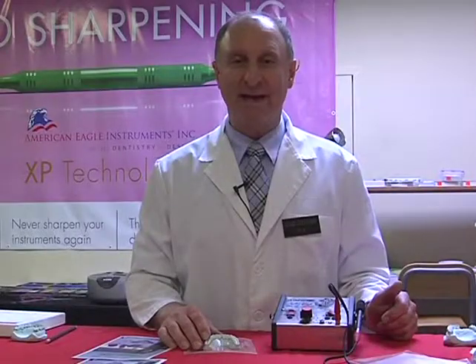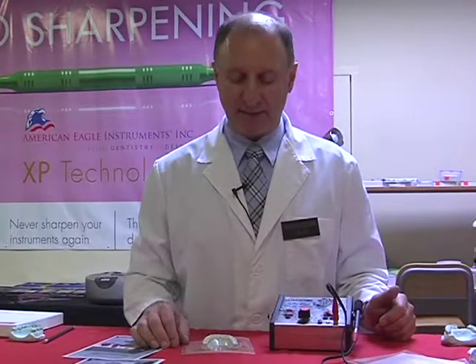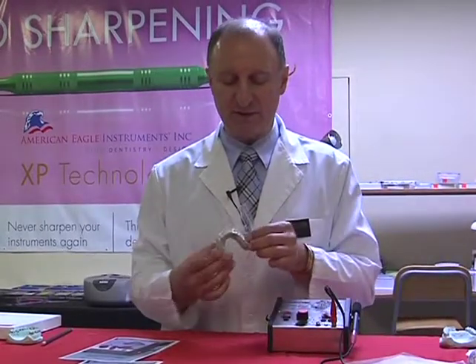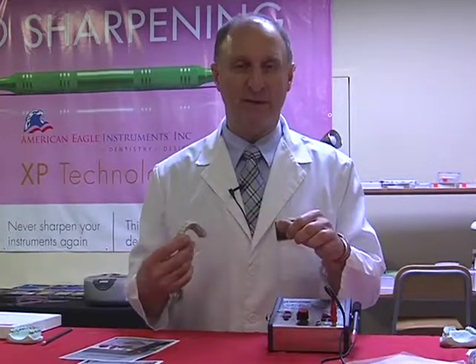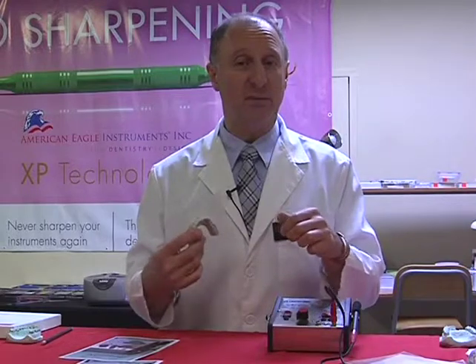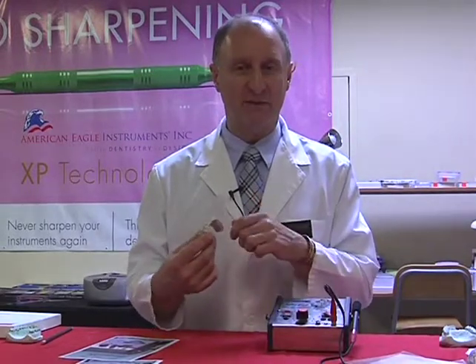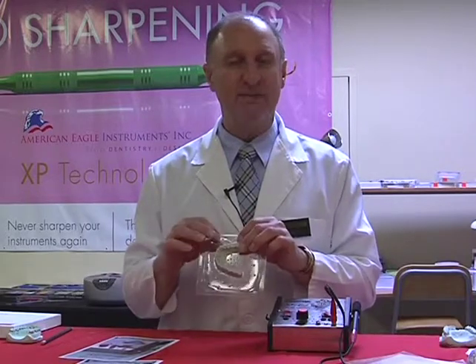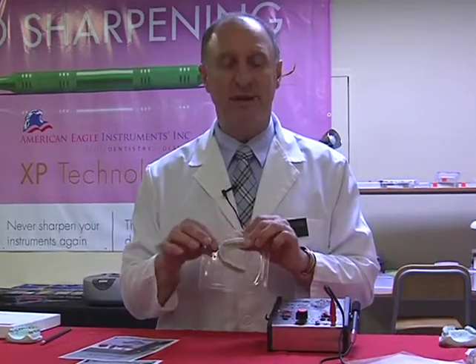For trimming our bleaching tray, instead of using a pair of scissors, in which case what a lot of people do is pull the bleaching tray away from the model, the problem with that is you can deform or stretch the material as you're pulling it away if there are a few small undercut areas which grab hold of that material, and so you can stretch it. So what I prefer to do is trim it on the model itself.